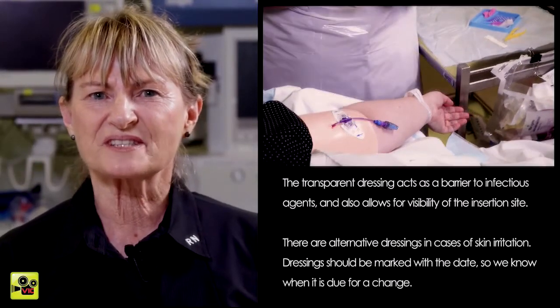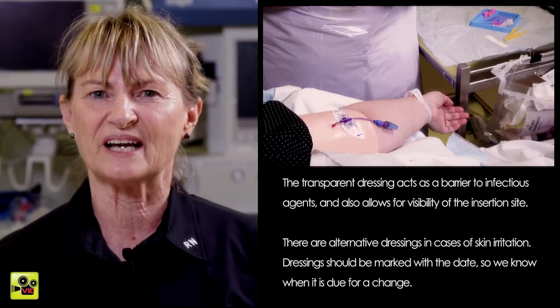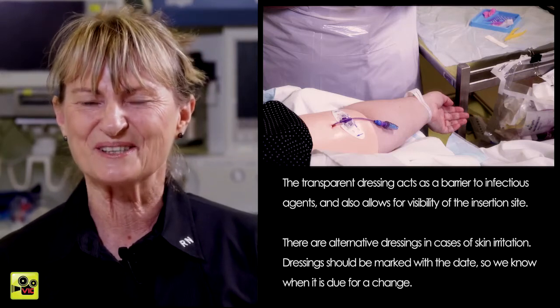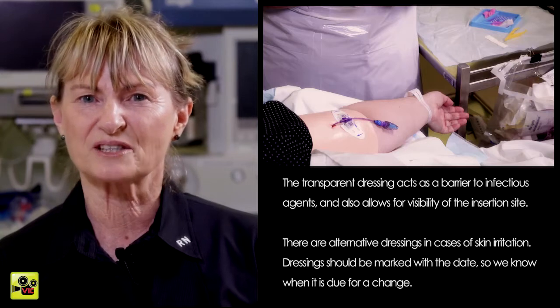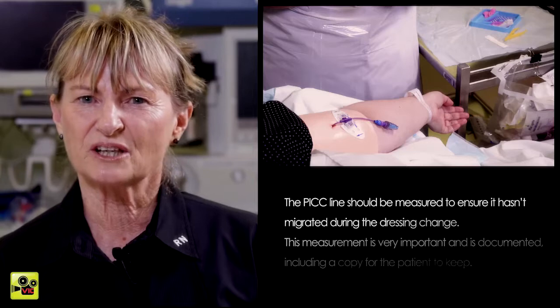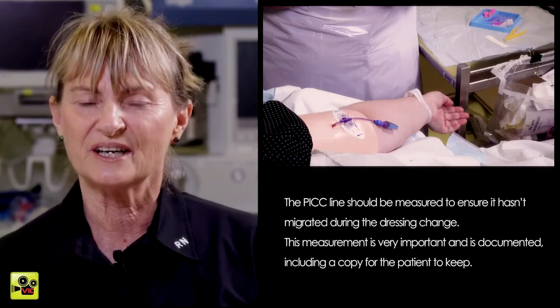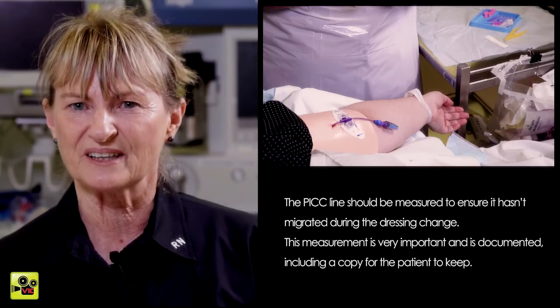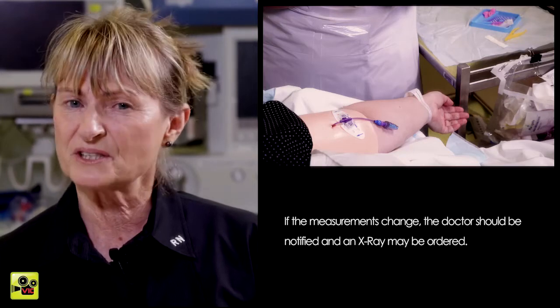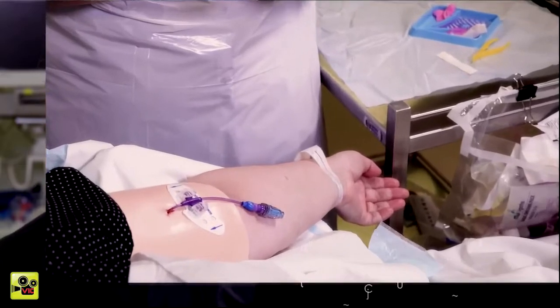The transparent dressing acts as a barrier to infectious agents. It also allows visibility at the insertion site. There are alternative dressings in cases of skin irritation. Dressings should be marked with a date so that we know when the dressing is due for a change. The PICC line should also be measured to ensure that it hasn't migrated during the dressing change. This measurement is very important and is documented, including a copy for the patient to keep. If the measurements change, contact the doctor. An X-ray may be needed.